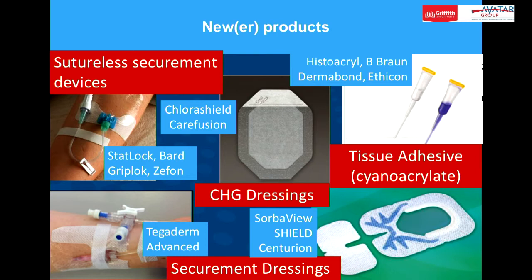And of course, now we're seeing a lot of these antimicrobial dressings. We know there's really good evidence that they reduce bloodstream infections in central lines. We don't know that in PIVs, but I guess it stands to reason that if they prevent microbial skin growth at one part of the body, they're going to do the same somewhere else. So again, if people are saying they're keeping a 3-day removal because they're worried about infection, actually, maybe we should think about the infection risk rather than time, which has been shown not to work.